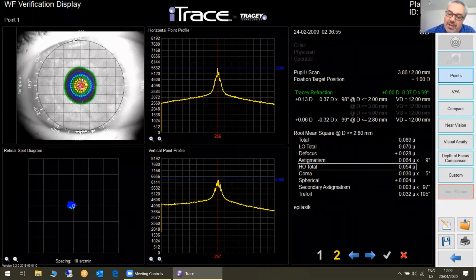So I would say Hartmann-Shack is if it's linked to your laser, go ahead. But it's not suited to measure your crazy patients. It's not going to help you with problem cases with rotated torics. It's not going to help you with tilted lenses. It's not going to help you with PCO. It's not going to help you with cataract detection. And that is dangerous. The second thing is, like you said, it is not measured on the visual axis.